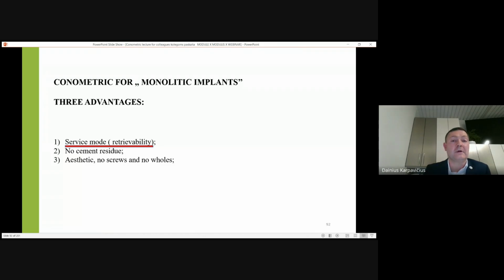I worked in this department of implantology in the university about 20 years, and we passed a lot of different kinds of treatment of implants, everything. And this cutting in the mouth is not good for the doctor, not good for the patient. Previously we were always looking for possibilities of retrievability, and for today we are very free. Just knowing solutions, knowing products, knowing angulations, you can do everything you want to do.